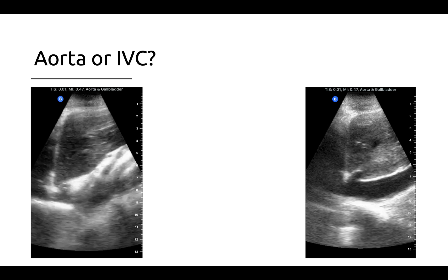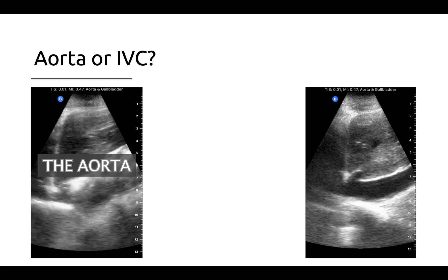The images you see here are obtained by placing a probe — typically either a phased array probe or curvilinear probe — on the abdomen in the epigastric area close to the midline, oriented in the sagittal plane with the probe marker aimed towards the patient's head. Fanning left and right, you should be able to identify two distinct linear anechoic structures representing the aorta, which will typically be just to the left of the midline, and the IVC, which will be just to the right.